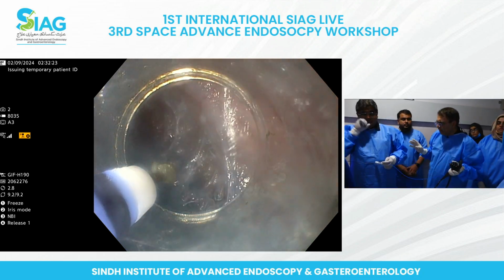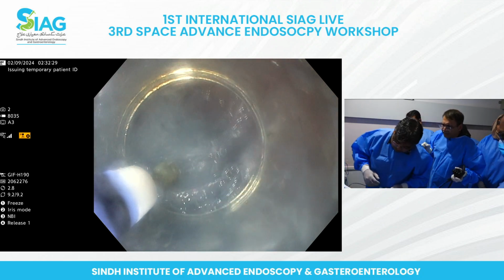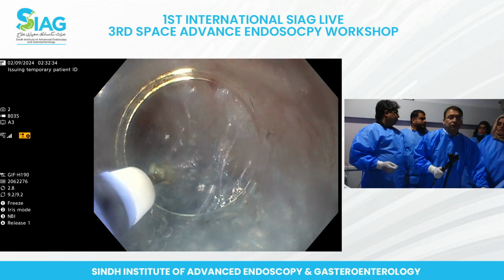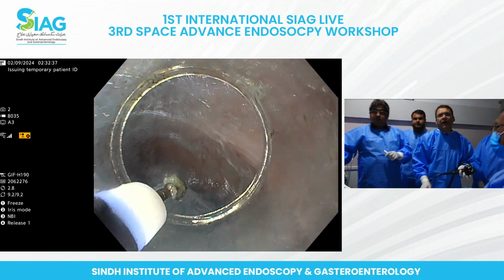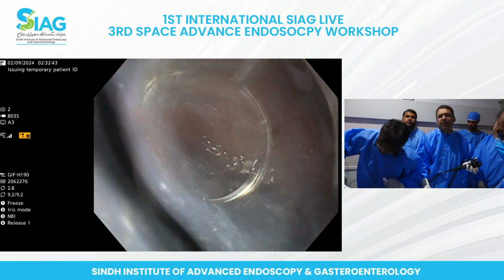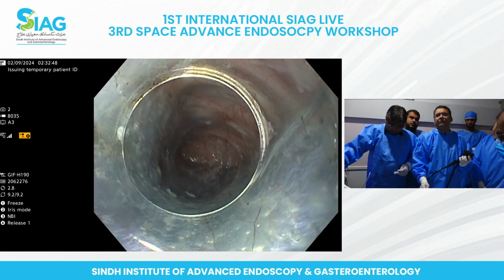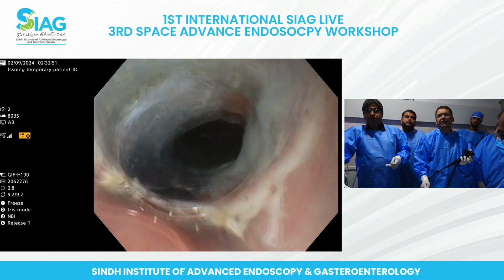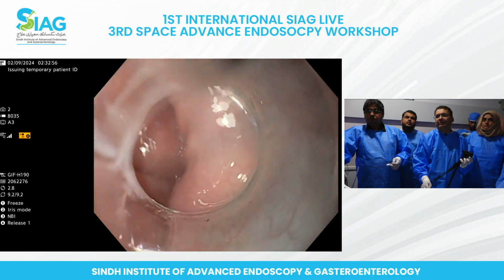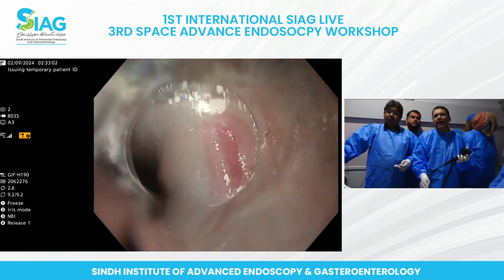And the other thing is CO2, sorry, where is our CO2? Can you decrease the CO2? Yeah, reduce the pressure. Yes, reduce the pressure. I failed to mention that once you get into the tunnel, then you can really decrease the pressure. Look at that, we have already done quite a bit of tunnel. And if I go out, you look at the tunnel, it's a very straight tunnel because I'm paying attention to the orientation. Okay, so we have done half of the tunnel. I'll go back into the tunnel.